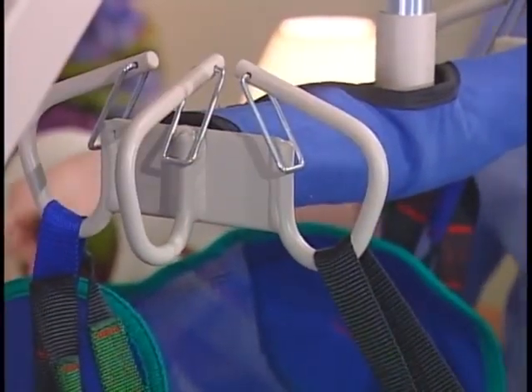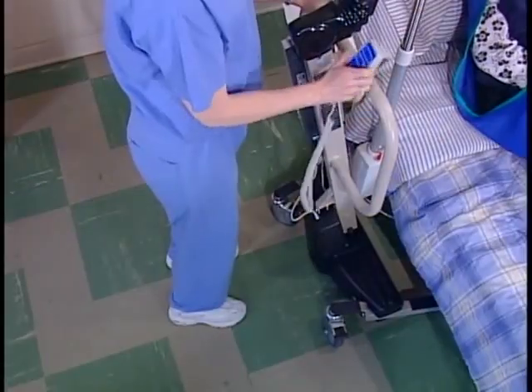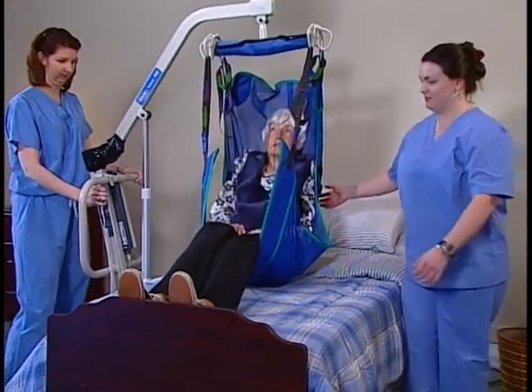Before performing the lift, engage the brake on the bed. Position the resident flat on their back in the center of the bed. Make sure the rail opposite you is raised.